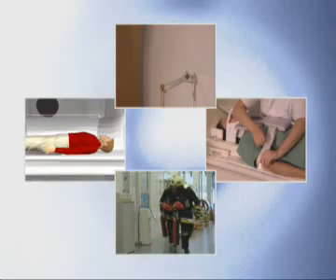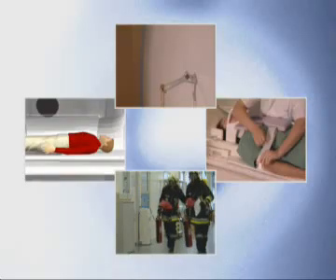them. Please be aware that this video does not claim to be complete and by no means replaces the system manual or operating instructions.